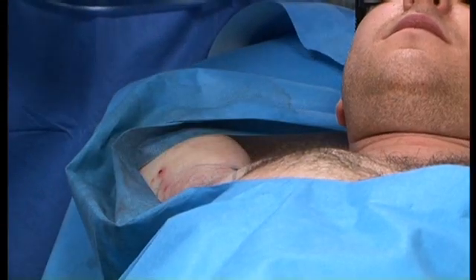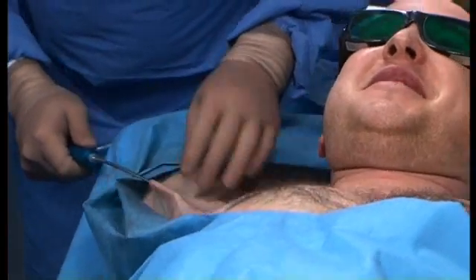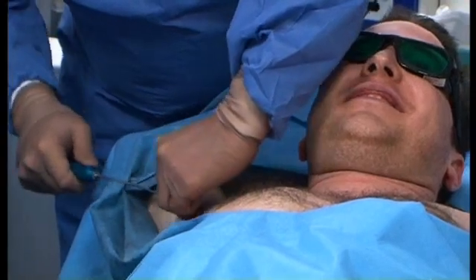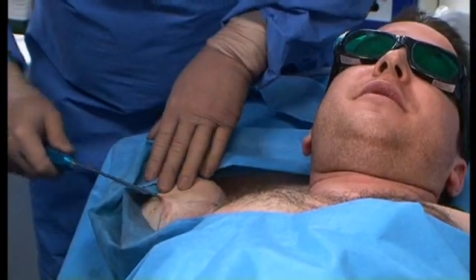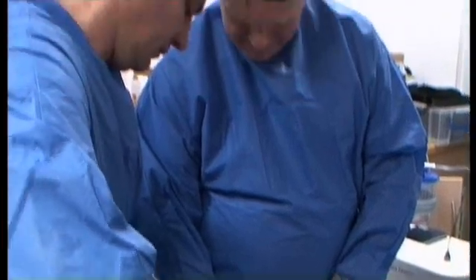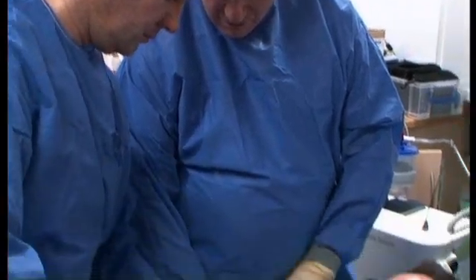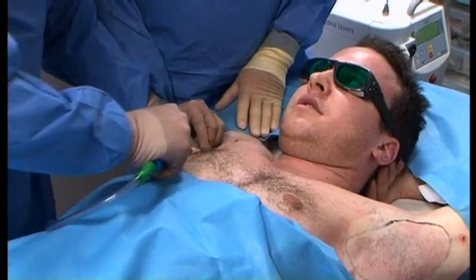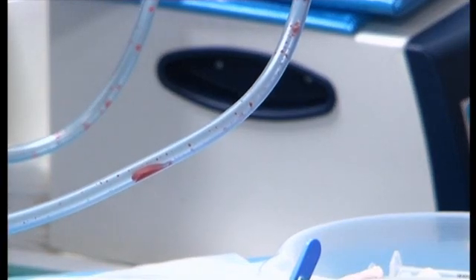So are we going to see the debris coming up? You might see the little bits of it here. You sound like you really wanted to see that — it's quite sadistic! Can I see it coming up? Oh, I'm interested. And what you do here is you actually push the skin. Is that hurting? There was a little thing but now we're fine, don't worry. It's okay. You're very well thrilled enough to start writing up those films. There's only... So it's going to be putting a dressing on, and then the waistcoat over the dressing, and that pushes the dressing onto it, so it reduces your risk of bruising.